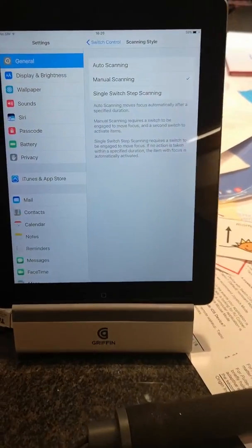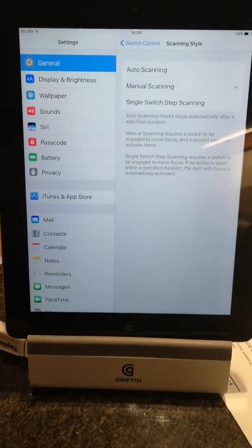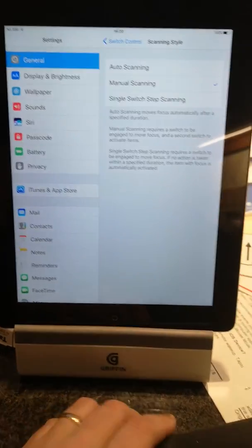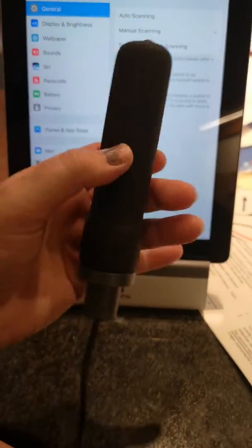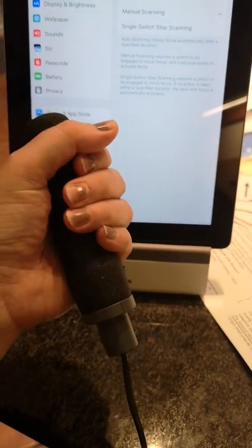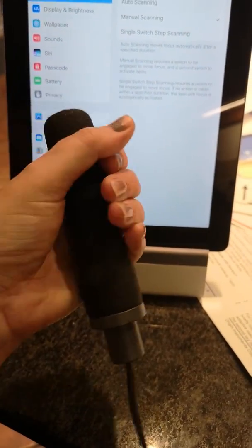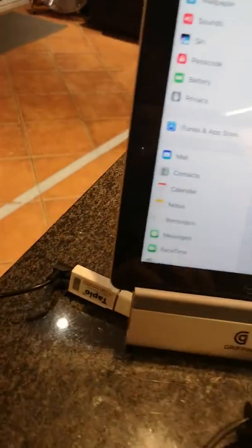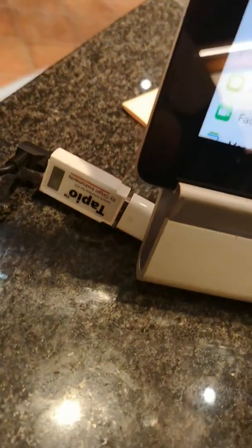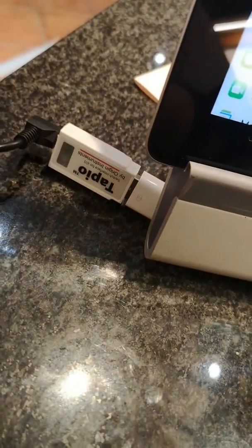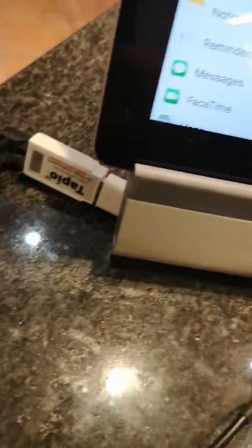Okay, I've set up the switch. It's a palm handheld switch with the Tapio plug and play interface.